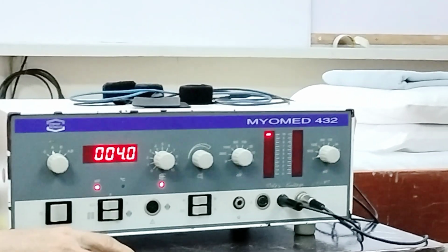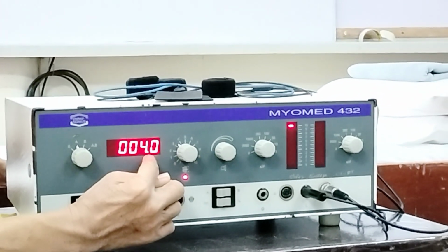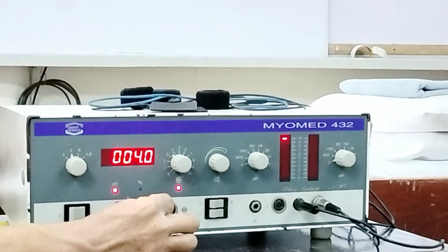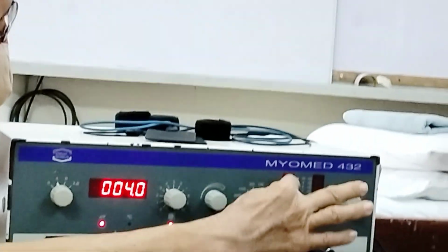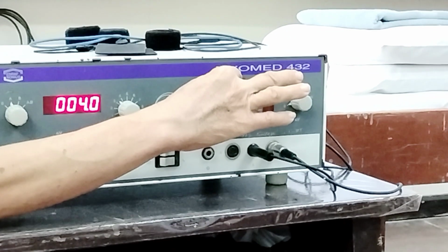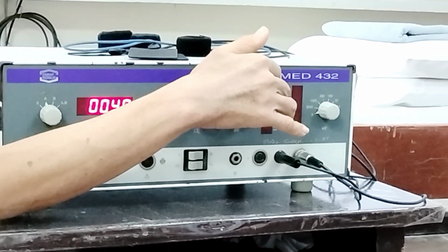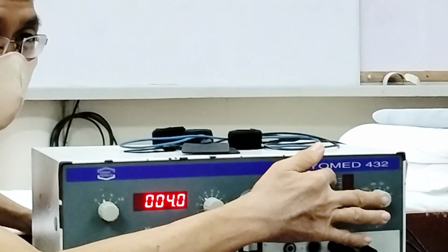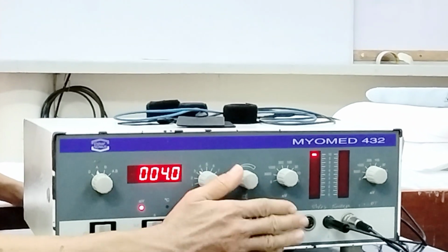Okay. If we look at this, in relation to this, it displays the signal. Observe there, what is registered? It's 4. So that means the received signal is 4 microvolts. So it went to 100% because you observe a signal that is beyond 3. Right? So, as you mentioned, if the bar is at 100% or level 10, that means it received a signal either equal to 3 or greater than 3.